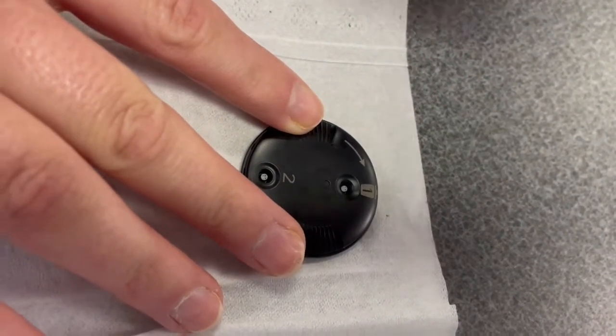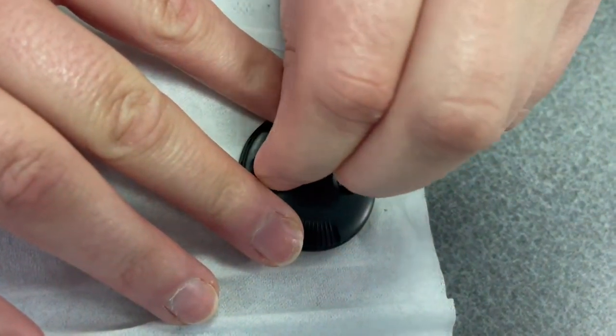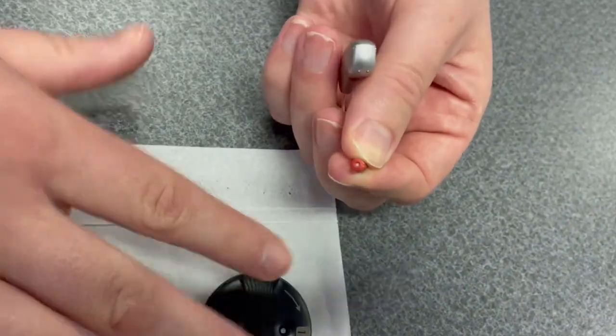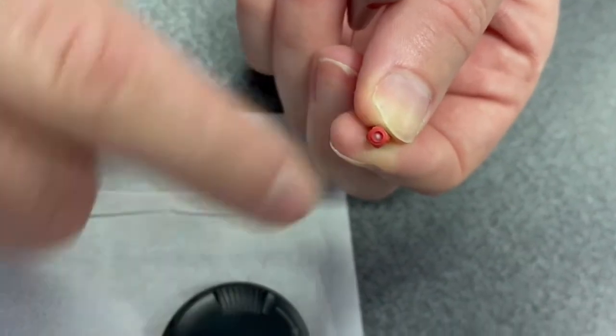Do the same thing for slot number two. Push it down in there. Once it clicks, pull it out. You've just replaced the wax guard in there.